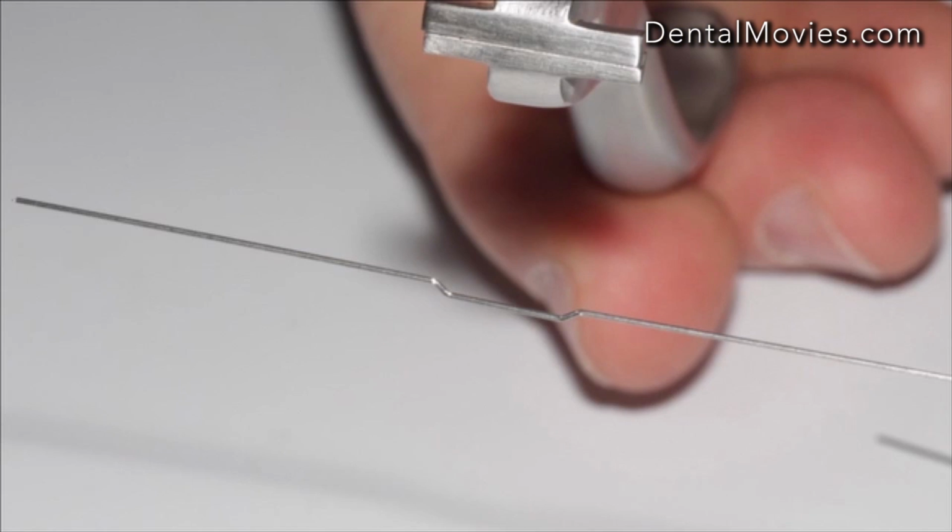Say you're about to finish and you've got a lateral that you need to bring down 1 millimeter. You can take the bracket off, sandblast it, clean the glue, re-etch, rebond. It's going to take you ages. Or you could just in 3 seconds do that little bend and bang, that tooth's going to move. There's the bend to intrude or extrude using your first order bend plier, your hammerhead.